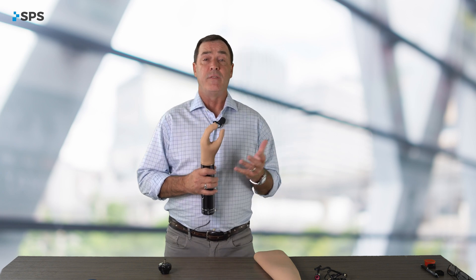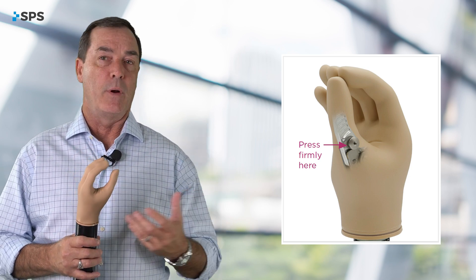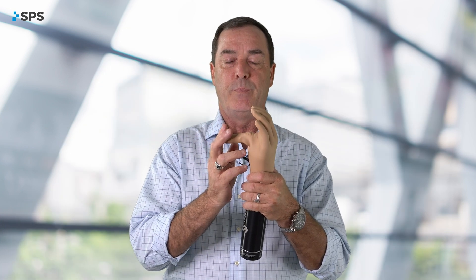One of the other really nice features that sets the Kinesi hand apart is the mechanical safety release. If the patient has gripped onto an object and can't release it — battery's dead, whatever — there is a safety release button right here on the thumb. You press it in and release the thumb. Then, to engage it again, re-push the button, pull the thumb back into position until it clicks, and it's ready to operate again.